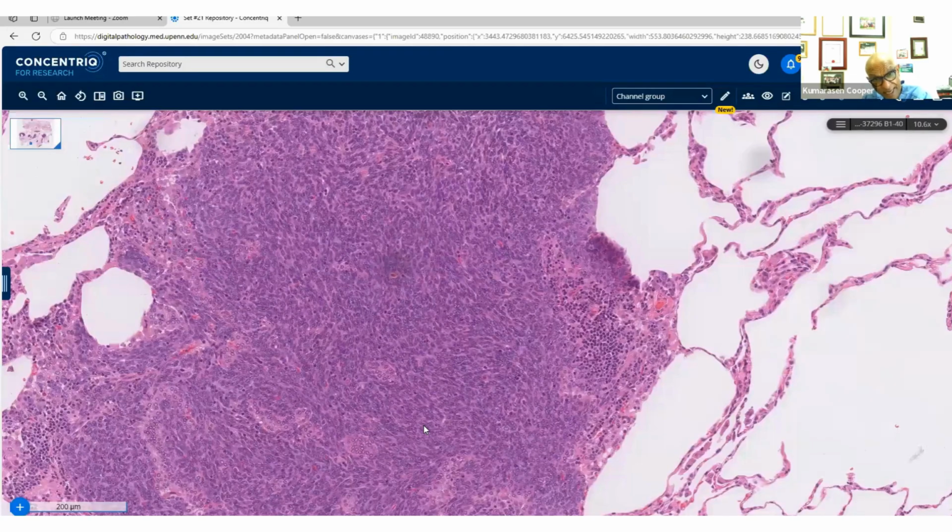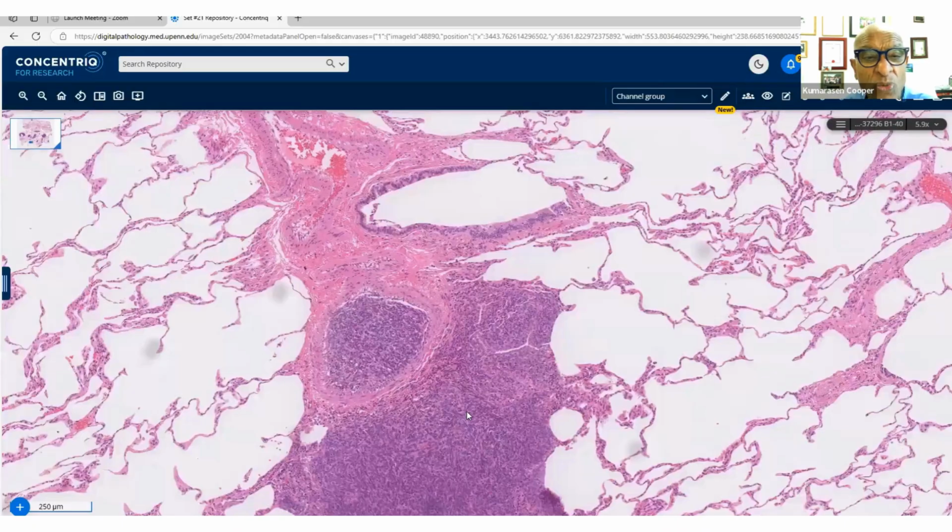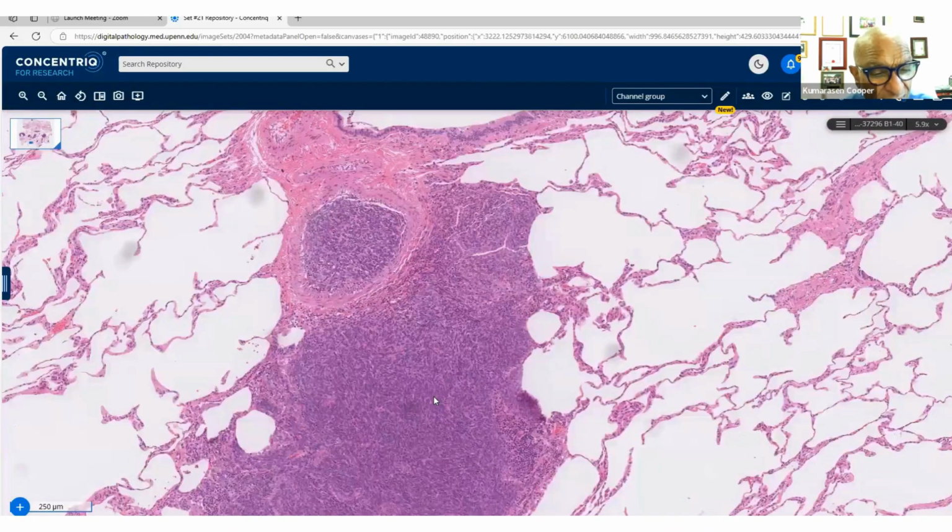And they can have this morphology. In fact, intimal sarcomas have a varied morphology and can be quite heterogeneous. They can look like this, highly cellular, spindled, even round cells. They can look like UPS, the undifferentiated pleomorphic sarcoma, which can look like anything, literally. They can be myxoid, myxofibrosarcoma-like, and they can even be peripheral nerve sheath-like. So any of them would suffice, and you have to think about it.